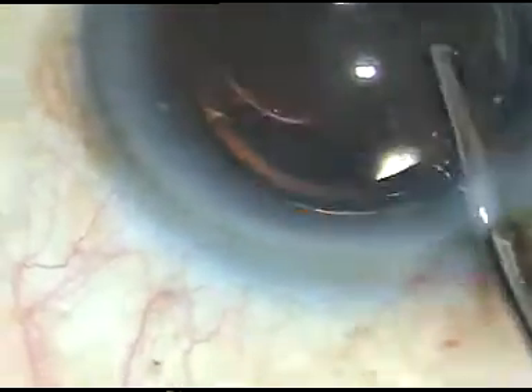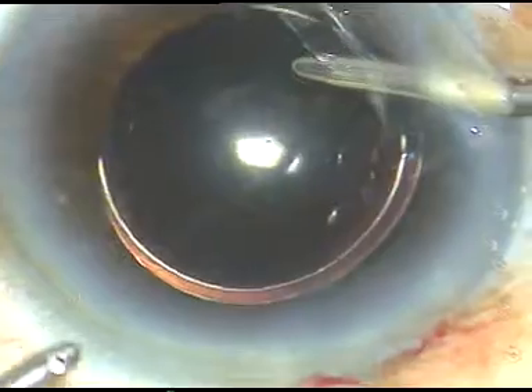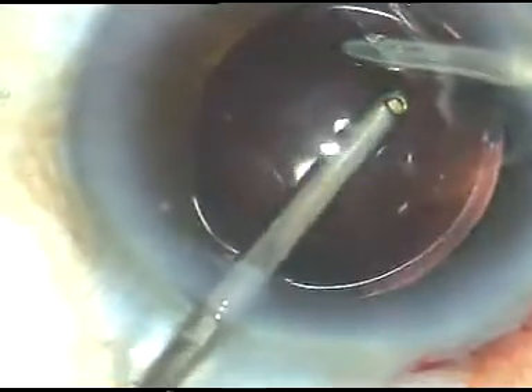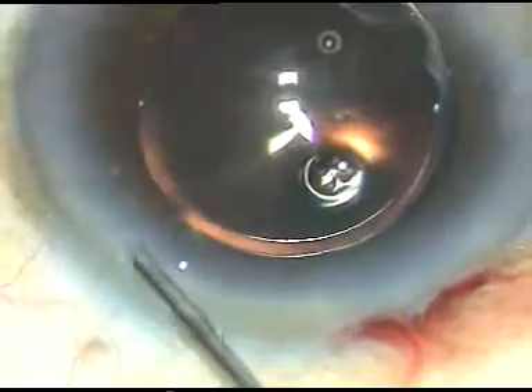I am irrigating out the viscoelastic substance with the irrigating probe. Now I use both irrigation and aspiration together to remove all the viscoelastic substance. I believe in thorough removal of viscoelastic substance.